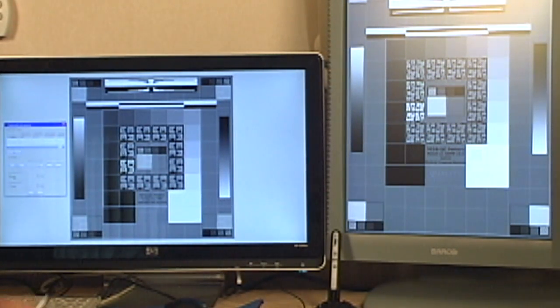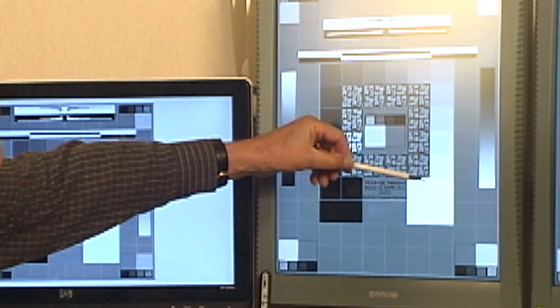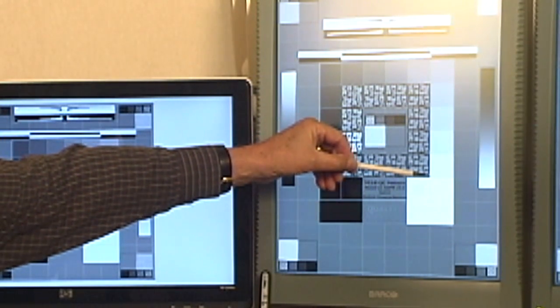What differentiates this in terms of a test pattern from a medical display versus the commercial display is we added some small attributes within the test pattern itself that would mimic what it would take for your eye to detect, say, a lung nodule or a lesion that was very subtle. And those are found as low contrast targets in each one of these grayscale blocks. And you can see this when the camera's going to have a hard time picking it up.